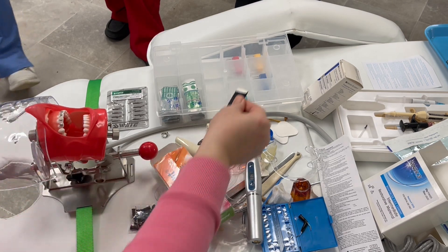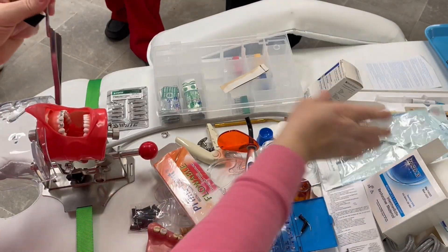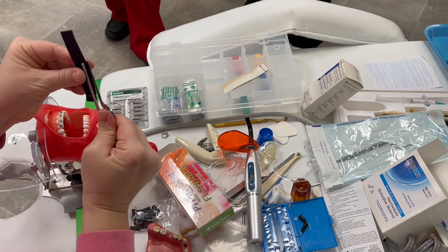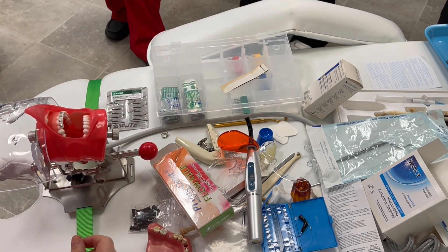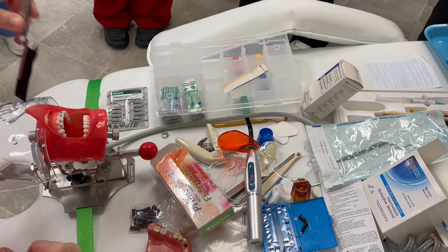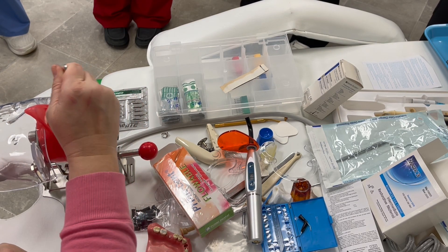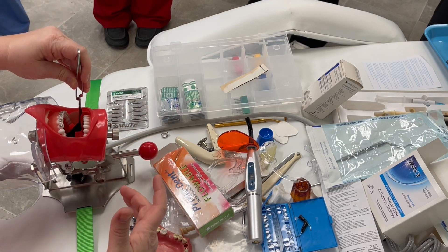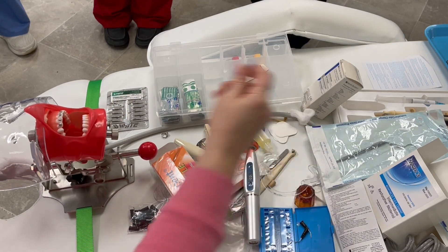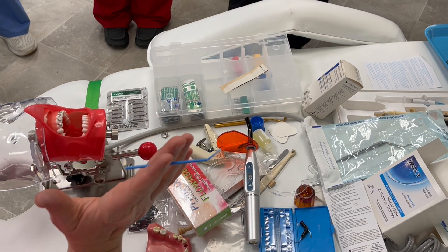Some dentists will just put it like this with their fingers, but there is an actual instrument specific for it — this is called a Miller forcep. They'll put it in here. Look at the shape of that — there's a cutout here. If you put it wrong, they're gonna bite on that and you're fixing their teeth for free. This is specifically for pushing the cheek out of the way. Tap, tap, tap. If all you see are the little blue dots on that composite and nothing on the other teeth, we've got some grinding to do.